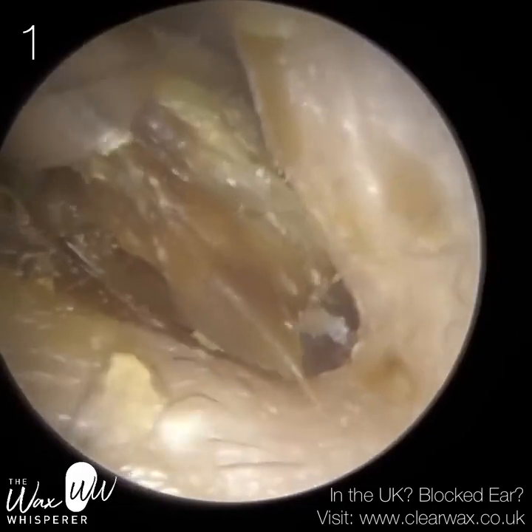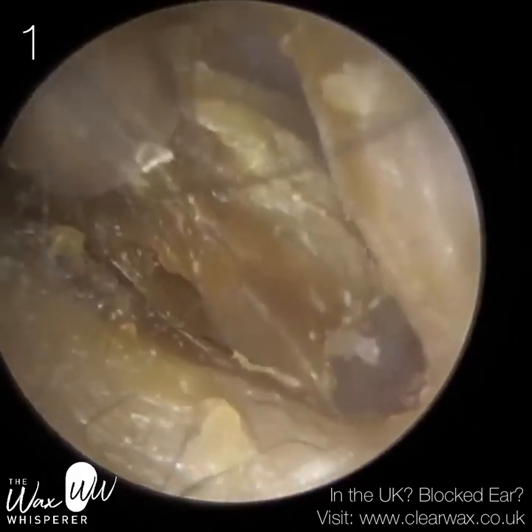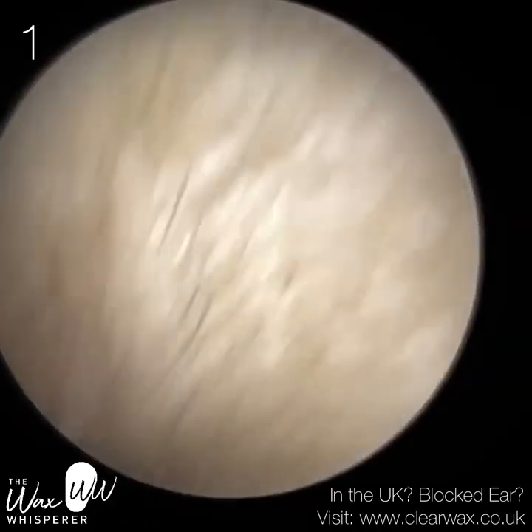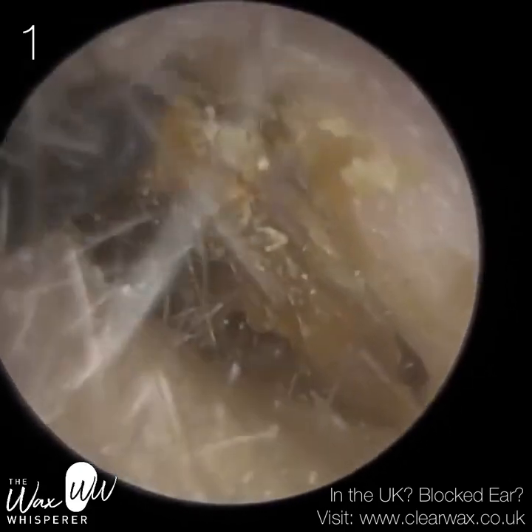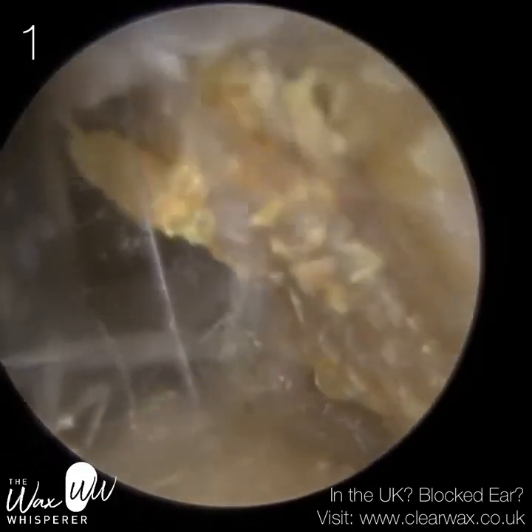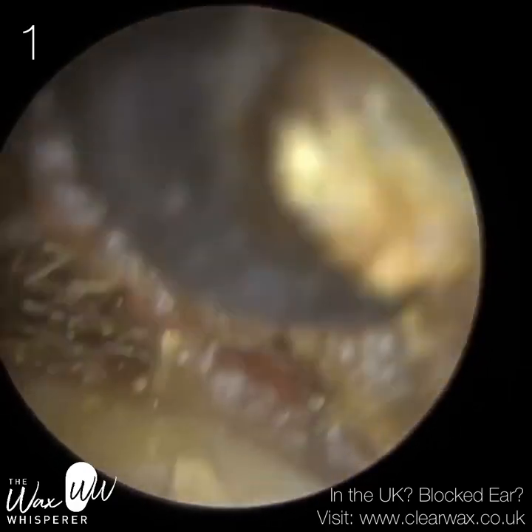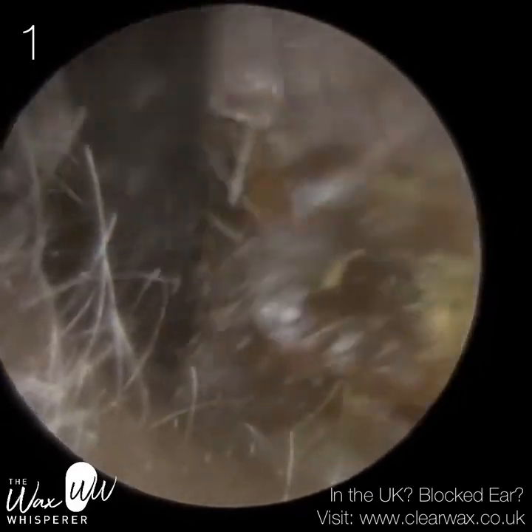In addition to that, you can see that she's got this lump of really dry wax keratin at the entrance of the ear canal. She's got a very, very narrow lateral aspect of the ear canal. So when we say lateral, we mean near the entrance. And I'm just using an ear hook to try and prise this away. It's a bit unusual because my auntie doesn't actually usually suffer from earwax or dead skin buildup. So at this stage I was unaware that her ear was infected.